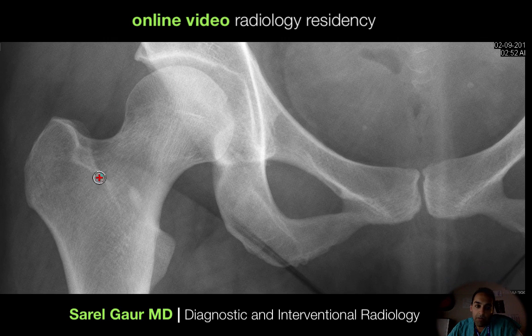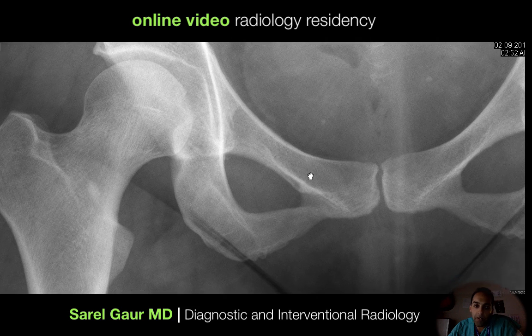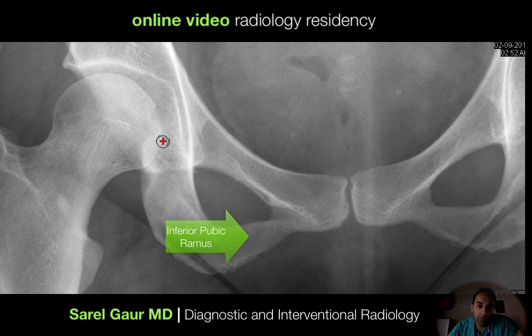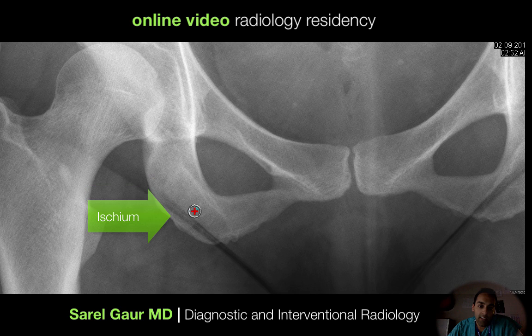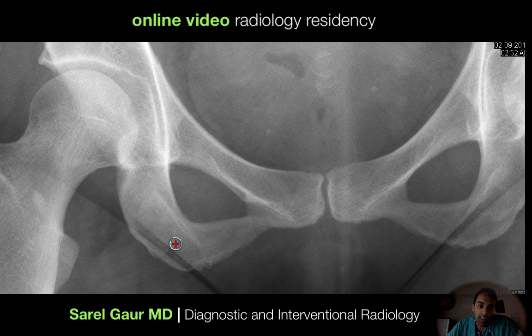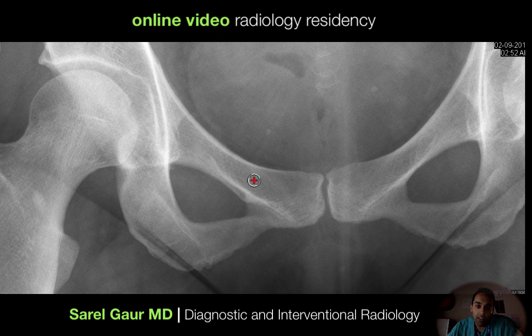I then move from the femoral neck and head into the pubic rami. Here you can see the superior pubic ramus and the inferior pubic ramus. This is the ischium — the bone that, when you're sitting down, is the bony protuberance you're sitting on: the ischial tuberosity. I'm definitely looking for any lucency or cracks in this smooth bone, the same with the superior and inferior pubic ramus. These are where subtle fractures occur that people miss, especially when they're zoomed out.